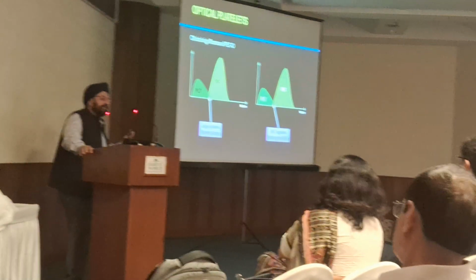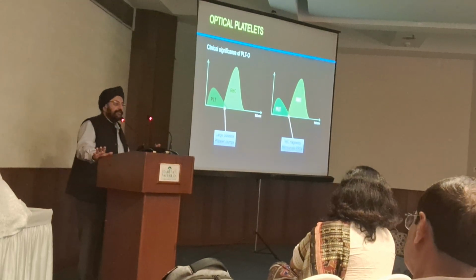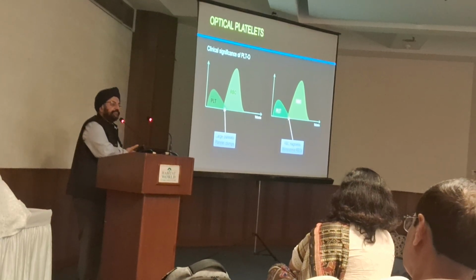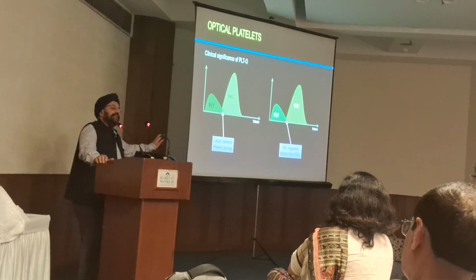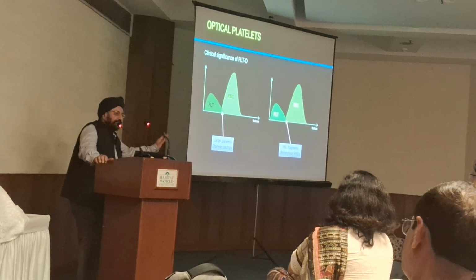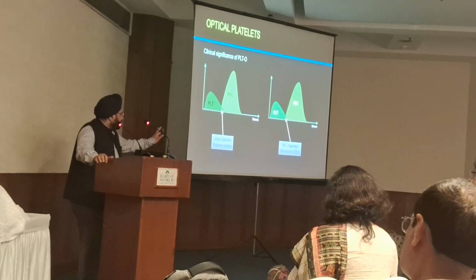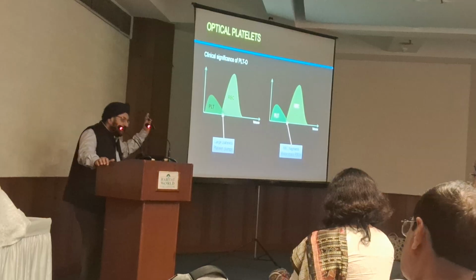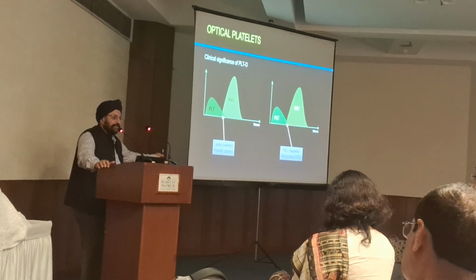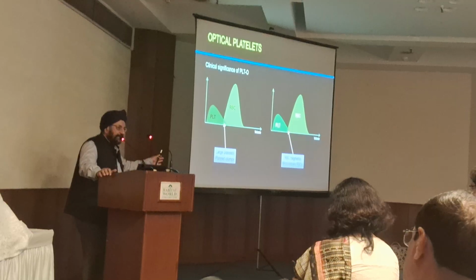50,000 platelets are counted into RBC, RBC का कुछ नहीं बिगड़ेगा. RBC तो already 40 लाख थे, 40 लाख 50,000 रिपोर्ट करते हैं. But if you count 50,000 less platelets, so say a difference between 80,000 and 30,000, it's a chalk and cheese situation. So that is why these impedance platelets don't work in dengue or any other cause of peripheral platelet destruction. You need to do a second method, which is either optical fluorescent or smear validation, whatever.